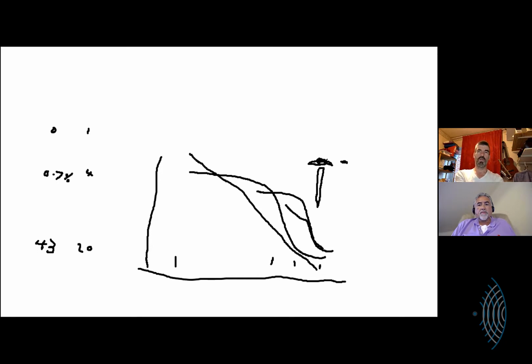But there's also all the other parts of what your resolution is made up of that make a difference. What happens as you change the other parameters, just playing with the gain and its importance, and the fact that these maps are not a big part, but they make a big difference when you start talking about missing subtle things, like when we talk about rheumatology and seeing subtle inflammation in structures, or telling, heaven forbid, a cancer that's mimicking a cyst, and understanding why you have to manipulate when normally it's very obvious that something is a cyst and you just go, tick, it's a cyst.